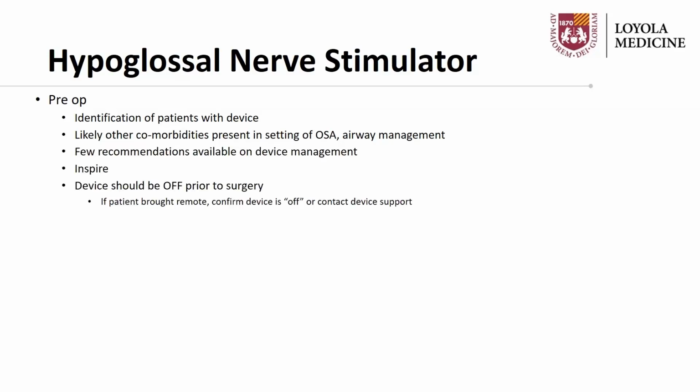As far as further device management, specifically pertaining to the anesthesia team, I found very limited perioperative recommendations using a fairly in-depth literature review. Therefore, I took the effort to personally contact this company named Inspire, the primary manufacturer of the stim, and I inquired about more specific perioperative management.